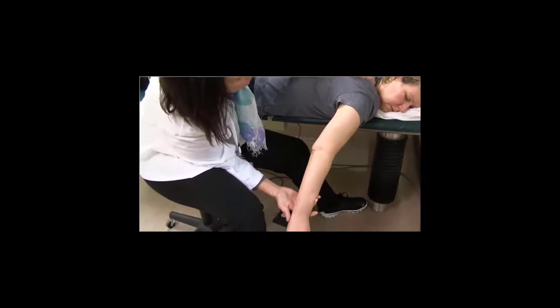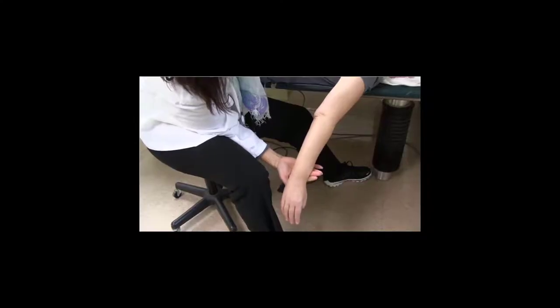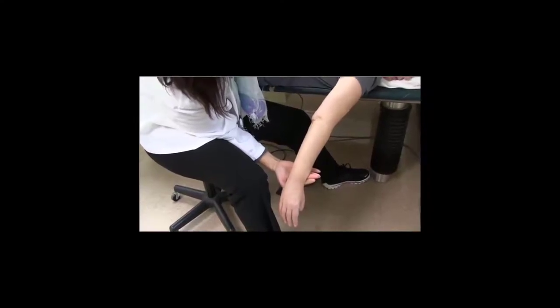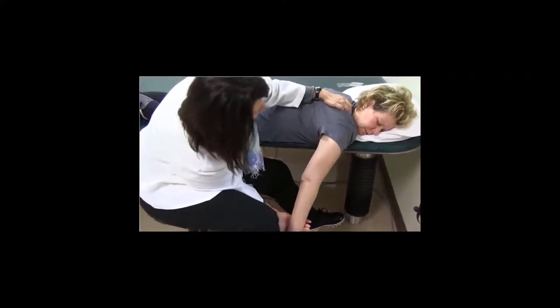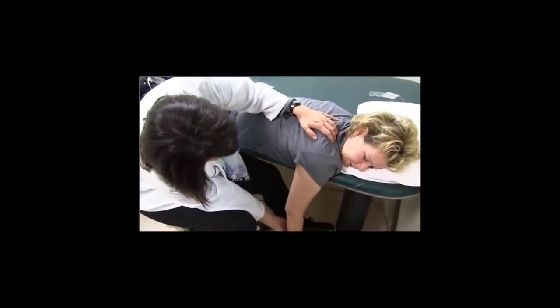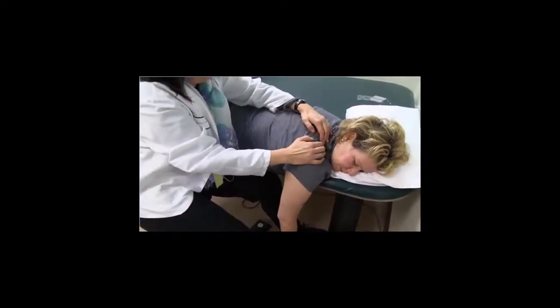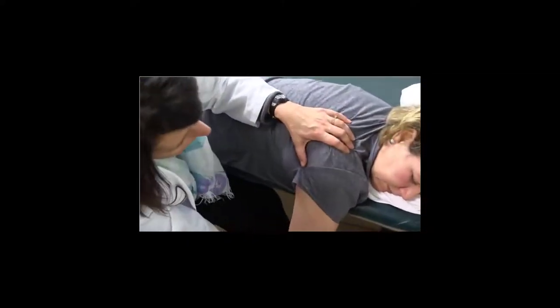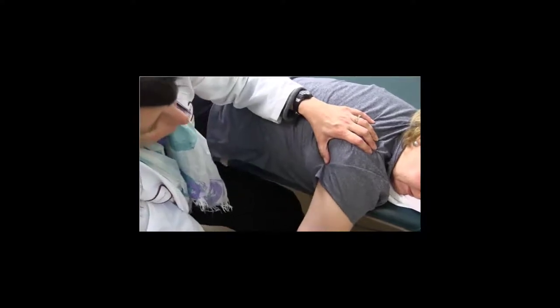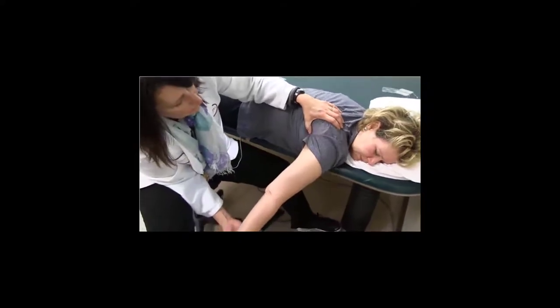Shoulders okay? Pain and all? No. Is there a stretch in the front? Stretch in the whole front of my arm. Yeah. Like from my elbow down to my pinky. Okay. Stretch, but not a painful stretch. Good. The stim is on and now it's off. On. Good work with me. Pull it up. Find that shoulder blade. Pull that shoulder blade down and back.